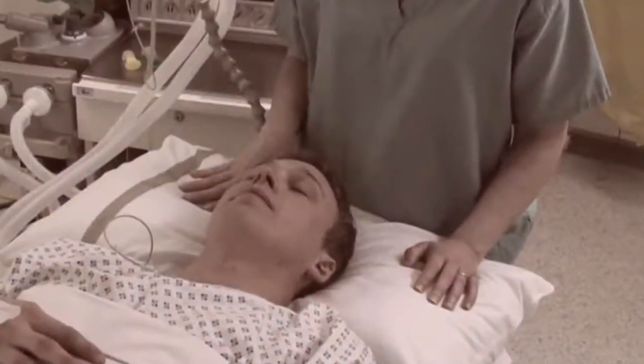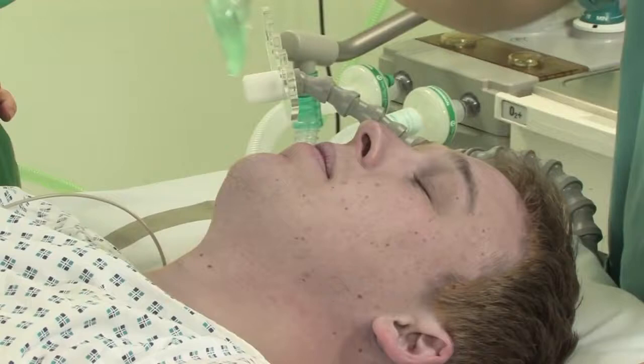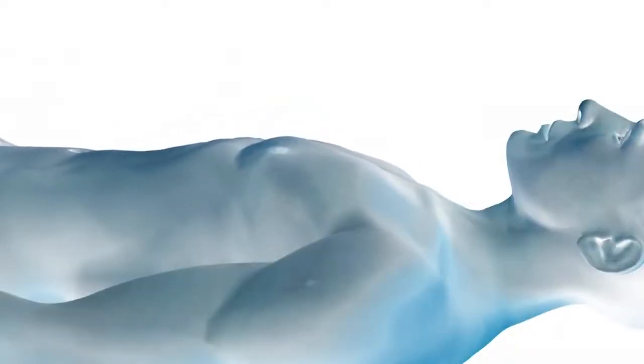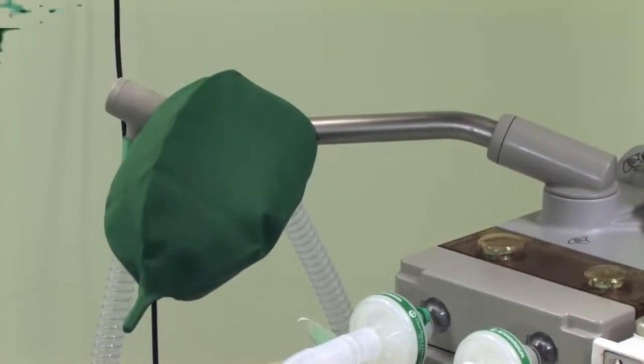Clinical signs of an obstructed airway include noisy breathing, increased cyanosis, seesaw movement of the abdomen and chest, and indrawing of the supraclavicular, suprasternal, and intercostal spaces during obstructed inspiration. Additionally, there can be seen a reduction in the movement of the reservoir bag of the anaesthetic breathing system.